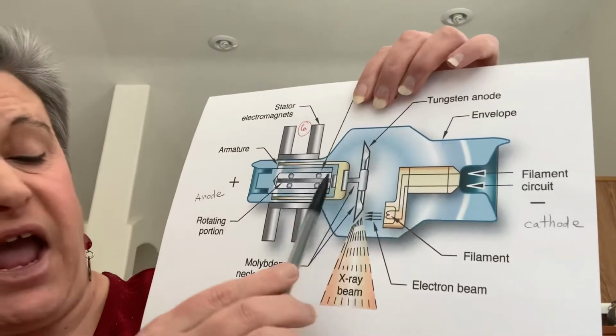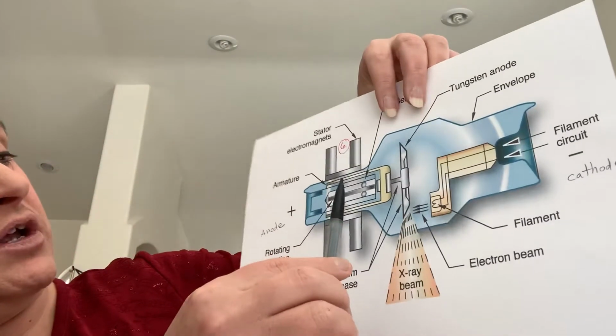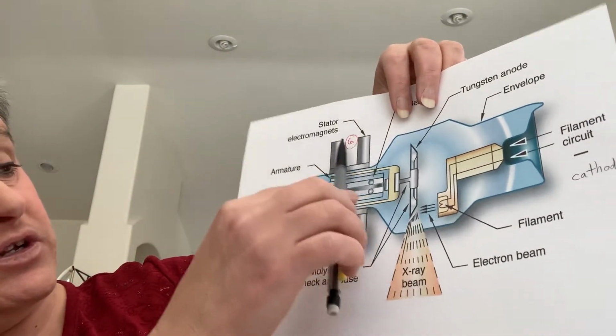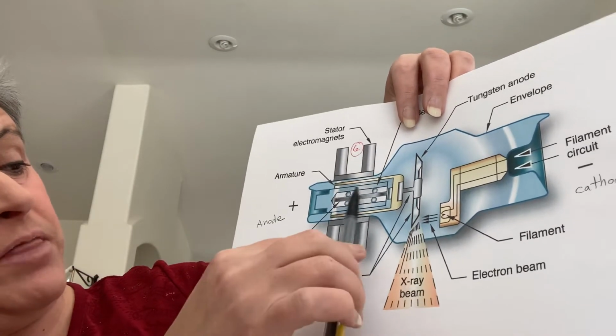The anode assembly, over here, contains the anode, the rotor, and the stator. The stator is right here. They're electromagnets, the stator, and the rotor is here. So those are the parts of the anode.